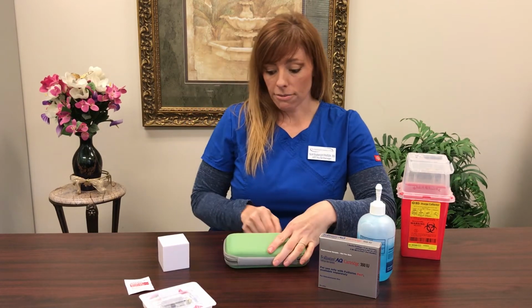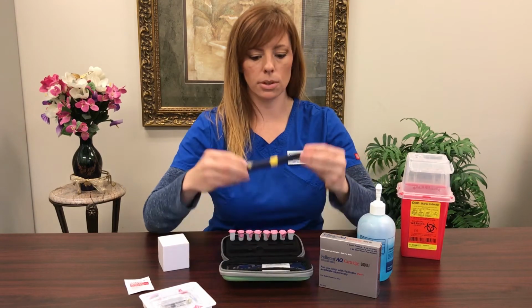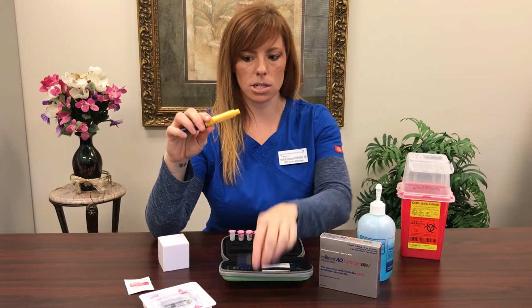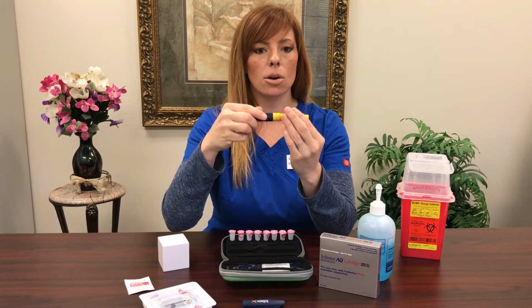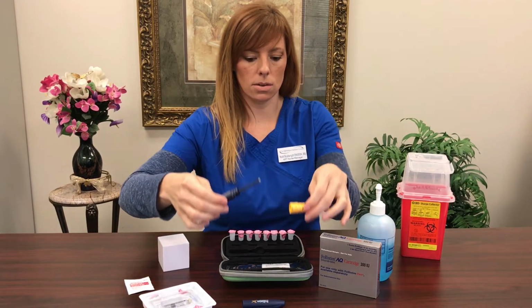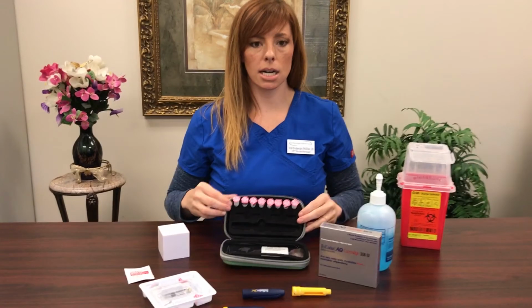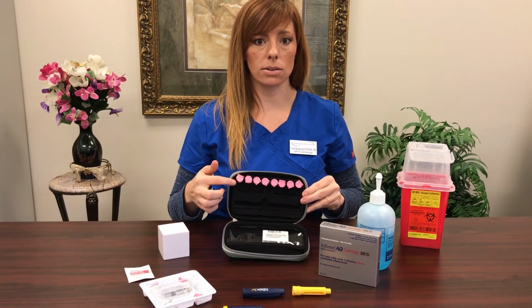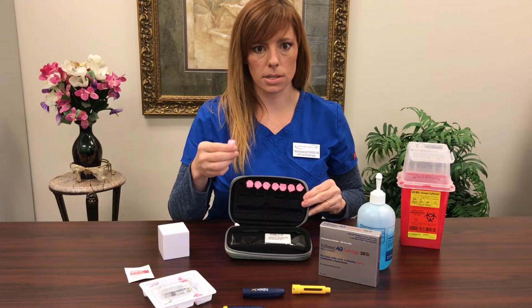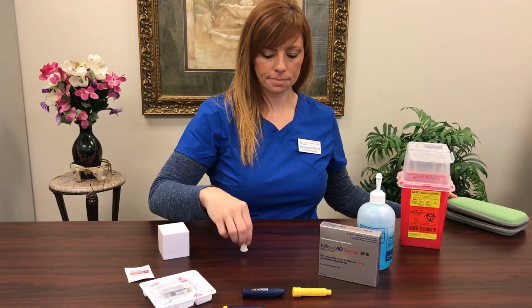In this kit, you're going to find your actual pen. It looks like an ink pen. It's blue. This ink pen comes apart in parts, so you've got a cap that just pops off, and then this yellow portion spins off. That's going to be what we insert your cartridge into, okay? So just set that aside. The next thing you're going to notice in this kit are your needles, and these are daily. You do not reuse this needle. This will be one particular for today's dose. So go ahead and set your box aside.